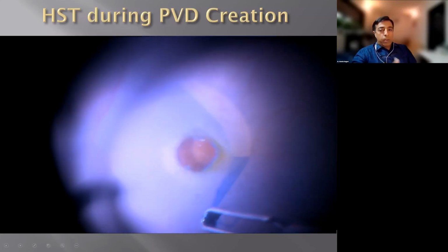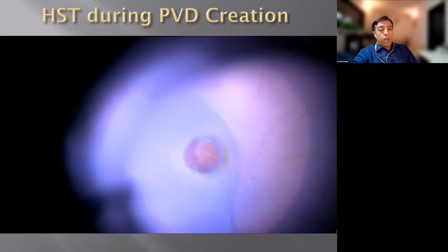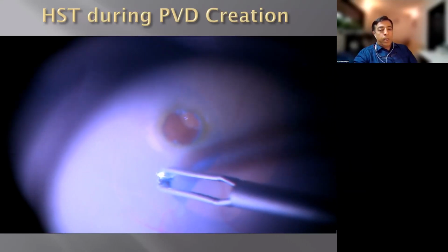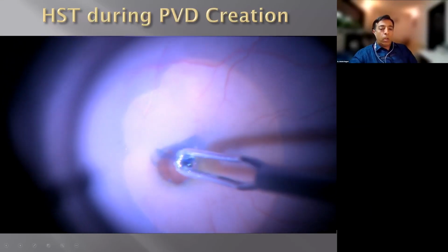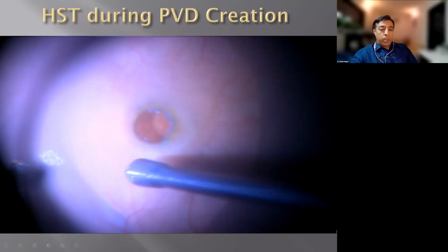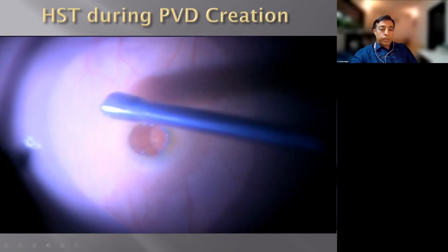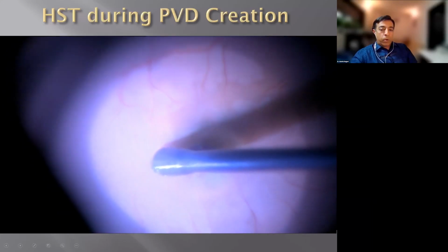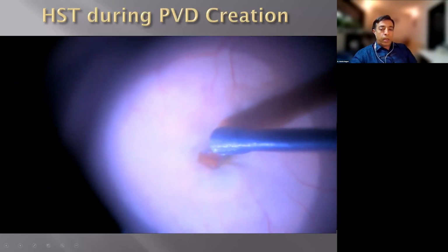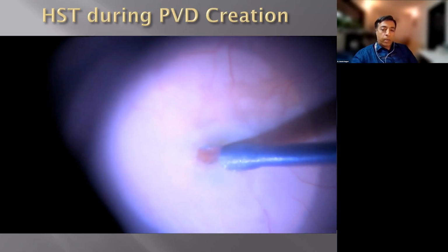Now you go and clear up the vitreous from there, then come back and do your surgery as if nothing happened. You finish your peeling, all that you would do normally for a macular hole. After making sure that you've cleared the vitreous from all that area, I'm also using the massager to make the edges of the whole tear malleable, and you can see that the stiff round edge has now become a little softer.